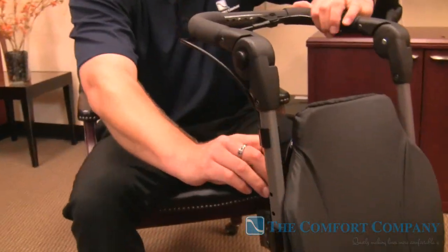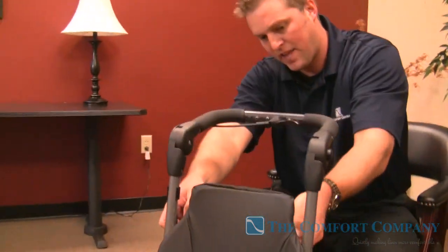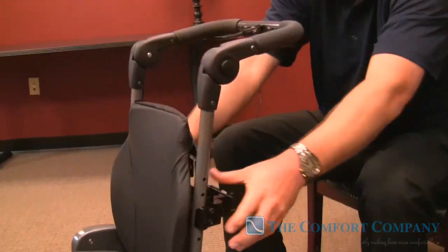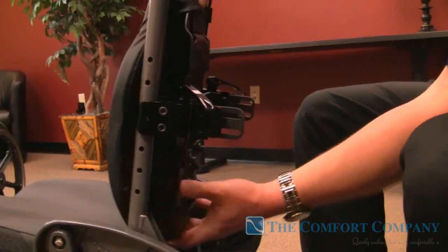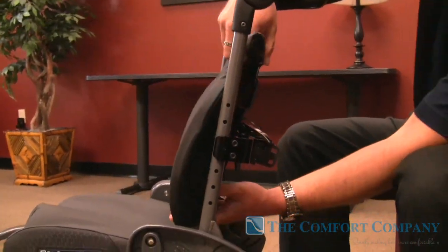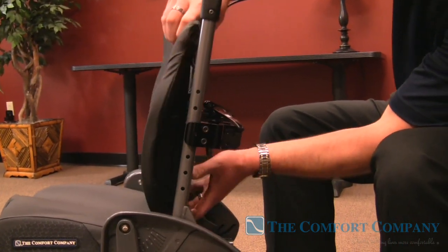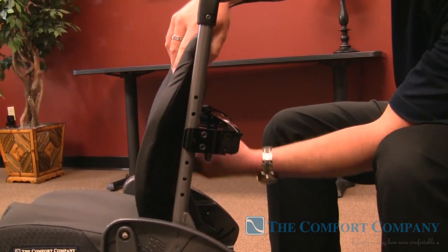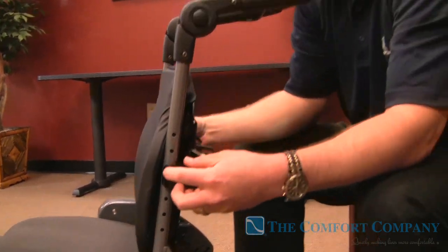Once we lock our plungers down, everything is still loose. I just want to show you the adjustability you can get with this back — quite a bit of angle rotation. Not only that, we can move these forward and we can move it back in between the canes. We can take these and flip them around so you can actually get this back out in front of the seat cushion by about five inches.